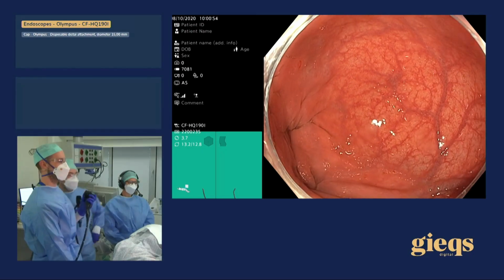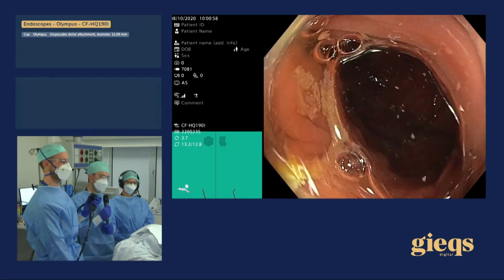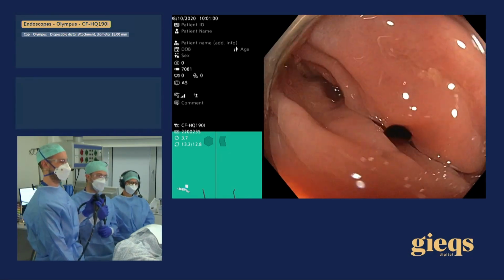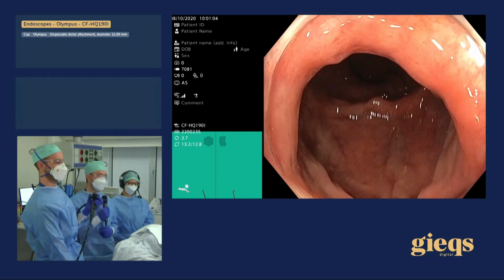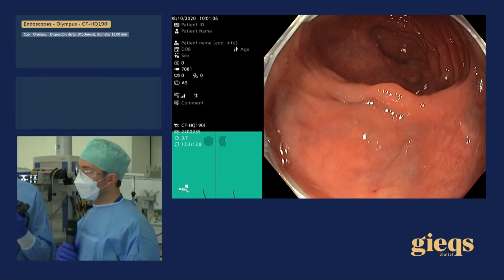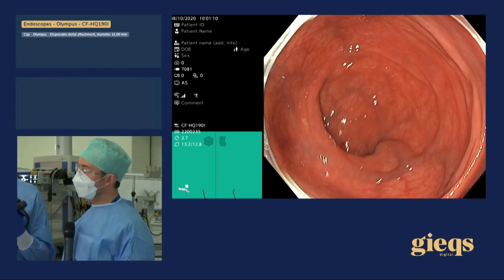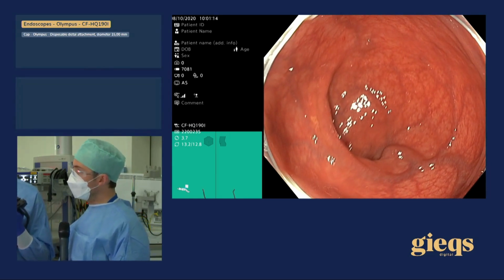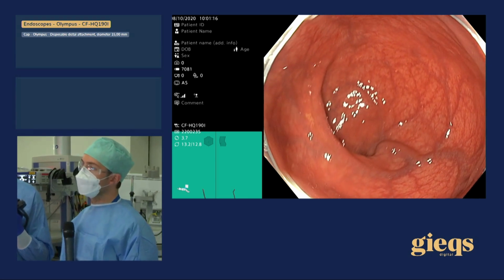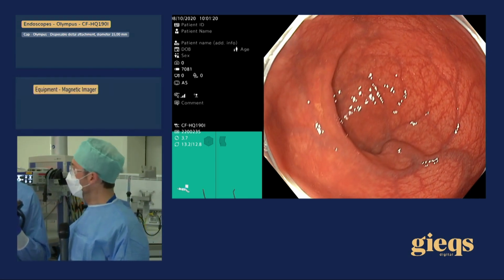So here with Christophe, and we're just going to start the intubation. I want some discussion from the moderators, from John and Roland. If you're watching this, if you can see the endoscopic image, about how he's doing. And so we're just going to let him start. So he's right here on the anal verge, and then I'm going to let him progress and discuss the findings as we go, and I'll discuss the scope guide image, etc. We'll do about 4 minutes of this, and then we're going to go to the beautiful video already provided to us from Cheltenham. So Christophe, take it away.